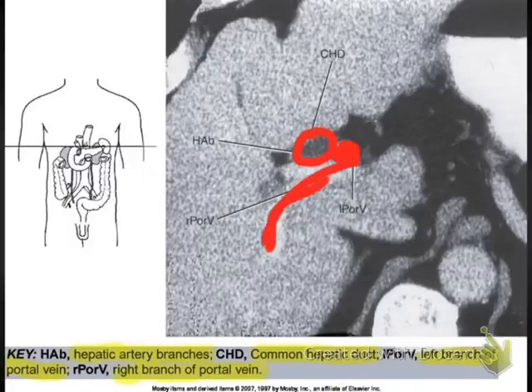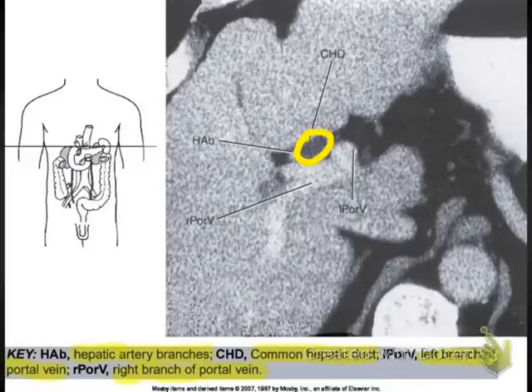We see that in the veins, we've got contrast filling or contrast bolus. However, we don't see really anything in the common hepatic duct. And it kind of has the density of a little bit of water. And so keep that in mind.